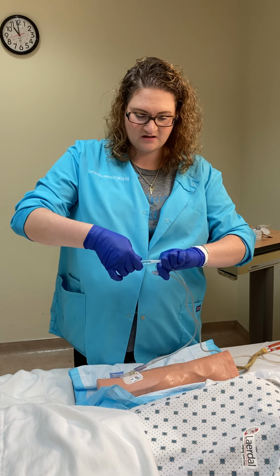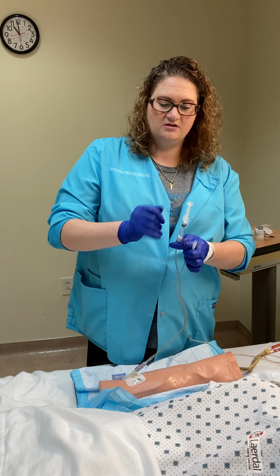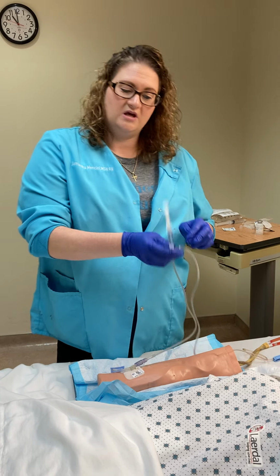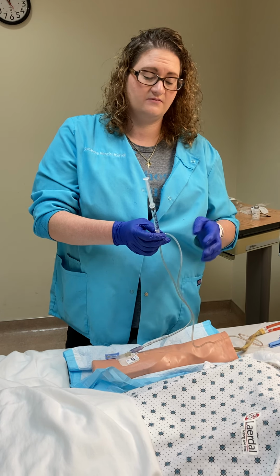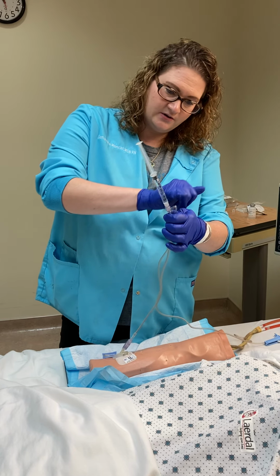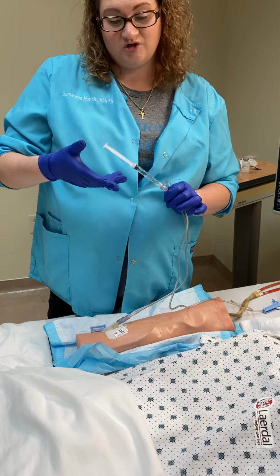So you did 15 seconds, let it dry, and I'm attaching the medication. I selected a 3 ml syringe for this because I only need 2 mLs. Smaller syringes allow you for a way more accurate dose than the 10 mLs. So for this, I'm going to crimp right here, and I said I need to do this over 2 minutes.